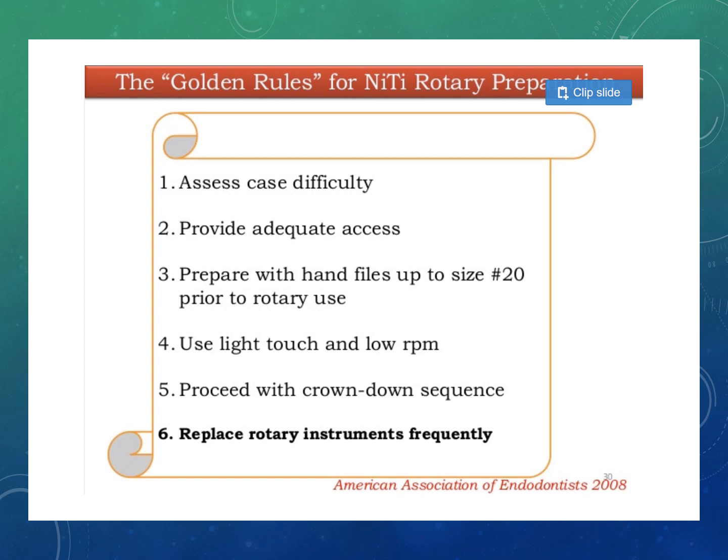No instrument can be used for a lifetime. All instruments will have their own time period after which to discard them. Usually the manufacturer advises that a rotary instrument like ProTaper is only single use. But some people are using them 3 to 4 times. If you are using them that way, make sure you check and note down the number of uses. Ideally it should be only one single use.